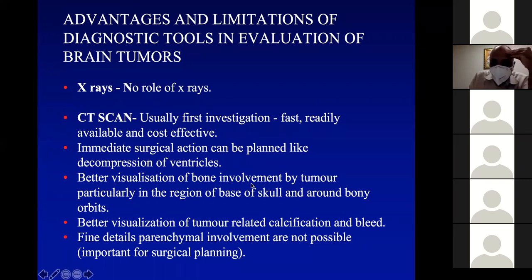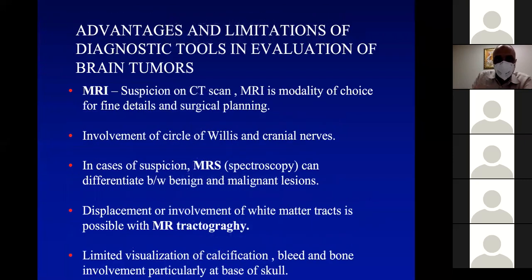Better visualization of the bone involvement by tumor, particularly in the region of the skull and around the bony orbits. Again, better visualization of the tumor. If there is calcification within the tumor, if there is a bleed within the tumor, again, that can be identified and the surgical planning can be easily done.